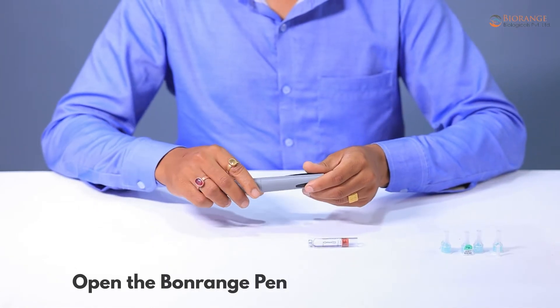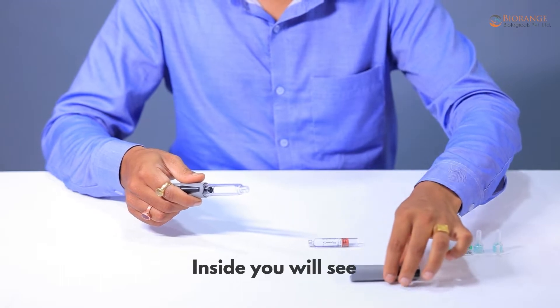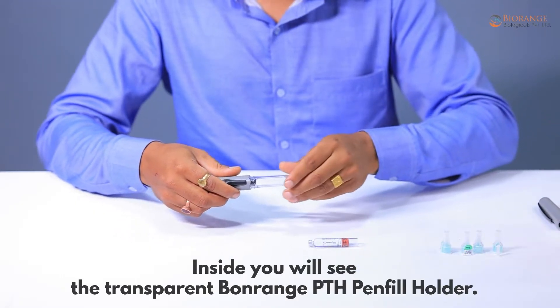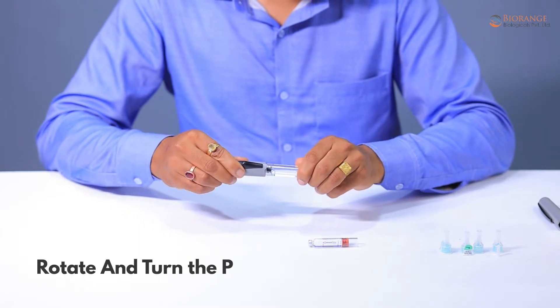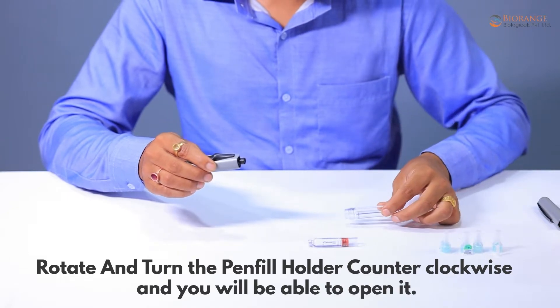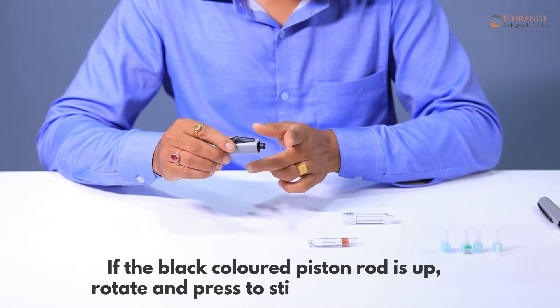Open the Bonrange Pen cap by pulling it out. Inside you will see the transparent Bonrange PTH pen fill holder. Rotate and turn the pen fill holder counterclockwise to open it. If the black colored piston rod is up, rotate and press to push it down flush with the pen.